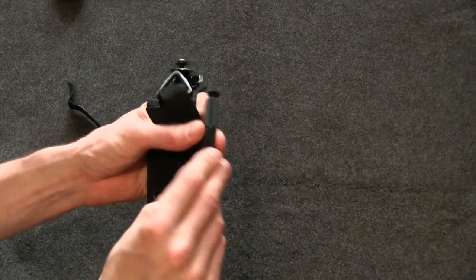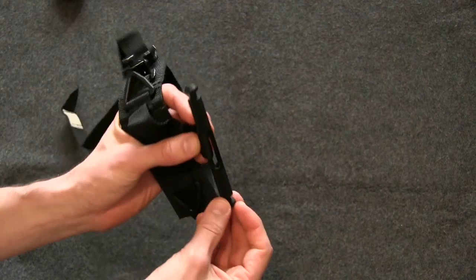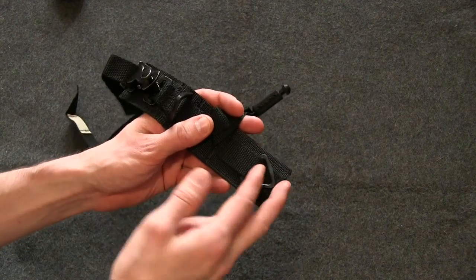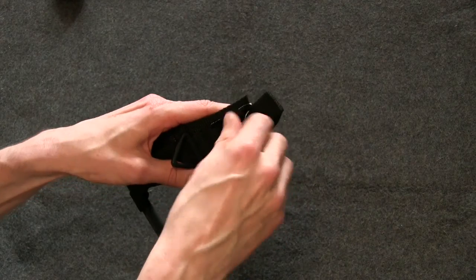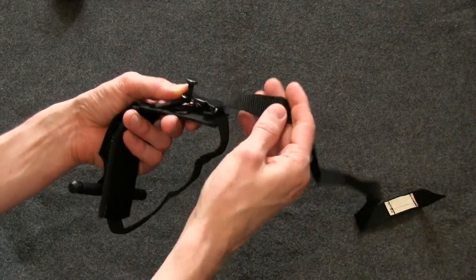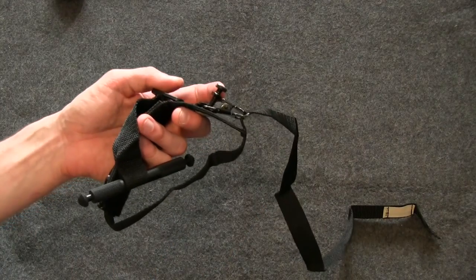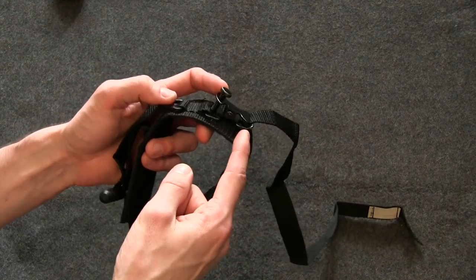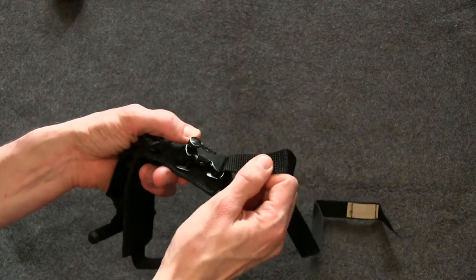So how this works is that we have the tightening mechanism here, which I believe is made out of aluminum or some kind of metal, and there's a little bit of play, so you can easily have it into these loops for locking. Here we have a metal buckle, and this is why I like this quite a lot. It's spring loaded, so you can easily have this loosened or tightened, and there's also this locking screw, which is quite important. Let's say if you have to move the victim who has had the accident, and you don't want to accidentally release this buckle, you can screw this all the way down, and it will prevent you from accidentally releasing the buckle.